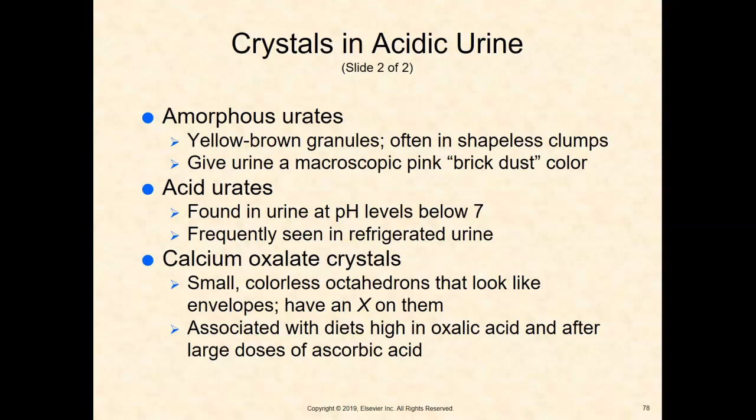Dogs love antifreeze, so we'll get vet samples from time to time where, if antifreeze spills out of a car engine and a dog is there, a dog will lick it up because it tastes really sweet. This is very damaging. It causes these crystals to form in the kidneys in large amounts, and it's also hard on the dog as well, and it can actually be deadly. So if we see those calcium oxalate crystals, that definitely is a sign that they could have drank antifreeze.